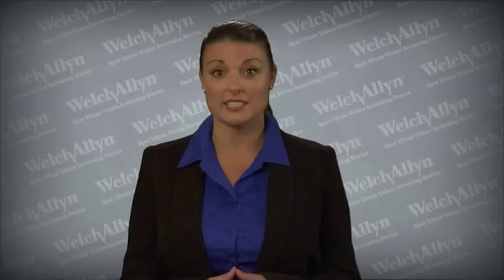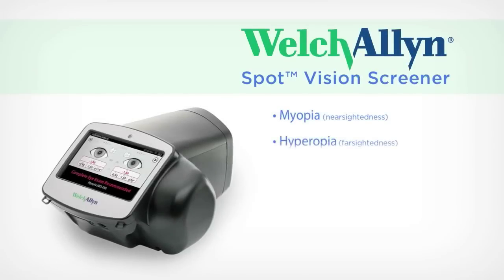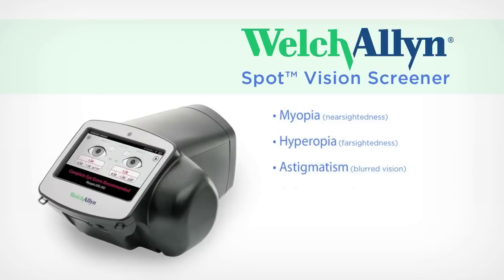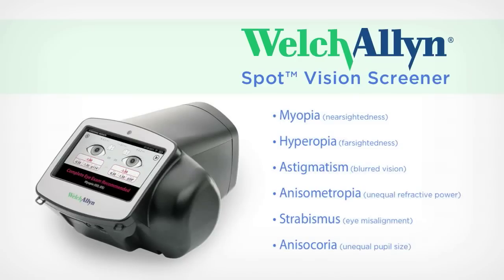Spot is powered by patent-pending technology that quickly detects the indication of the following vision issues: myopia (nearsightedness), hyperopia (farsightedness), astigmatism (blurred vision), anisometropia (unequal refractive power), strabismus (eye misalignment), and anisochoria (unequal pupil size).